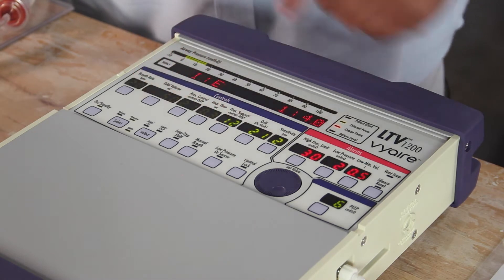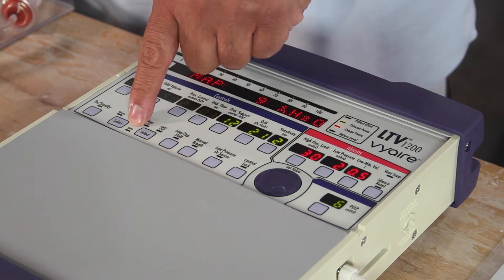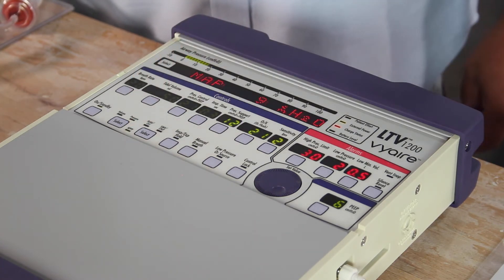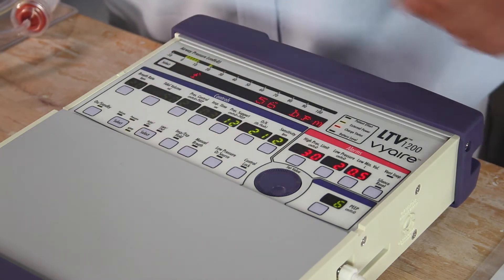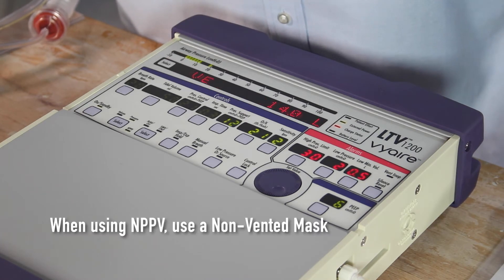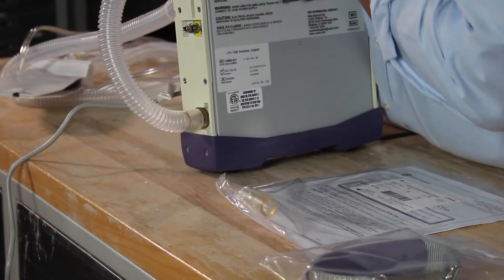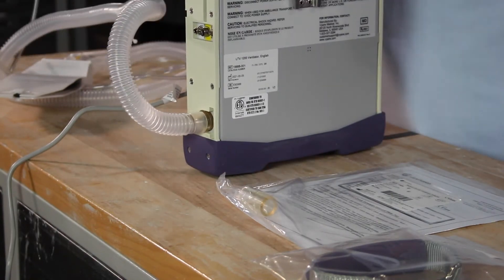Whatever's dimmed is not currently being used. We know we're in a pressure mode of ventilation, non-invasive positive pressure ventilation. The key thing when we're in NPPV is we want to use a non-vented mask because our exhalation valve is located on the circuit itself.